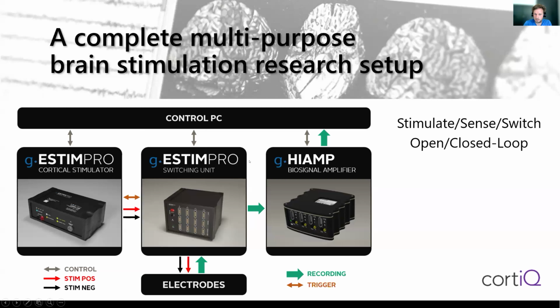It was already mentioned, open and closed loop, so it's very important to make this difference here. Open loop means that before you start the experiment, you set up all the stimulation parameters and the whole stimulation protocol a priori, and you're not really reacting to the response of the patient or to the recorded brain signals or biomarkers you're extracting. When you want to react, especially in real time, to the response of the patient, you're talking about a closed loop system.